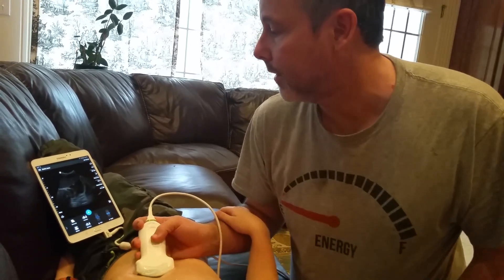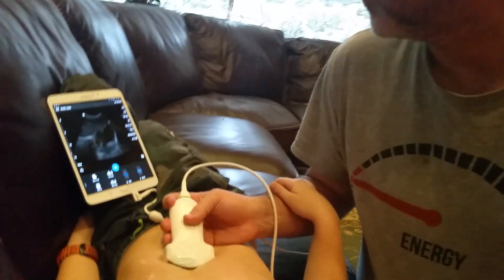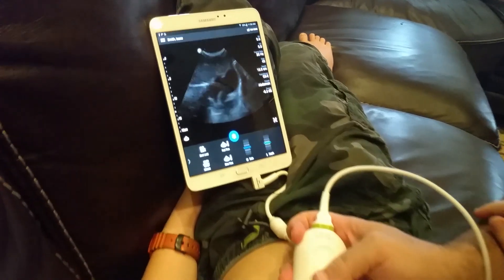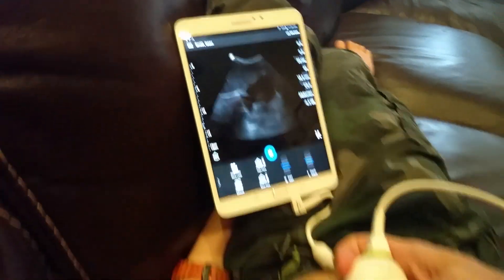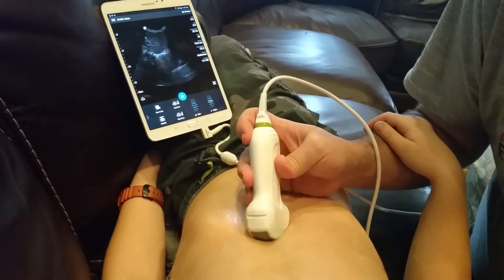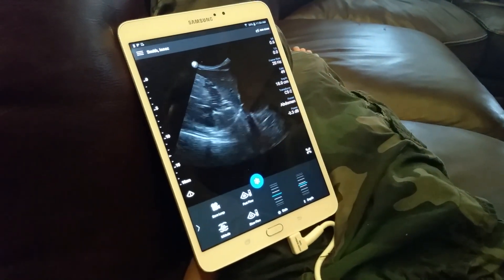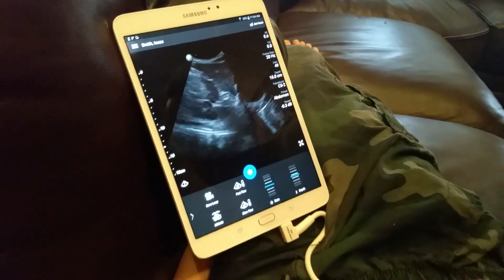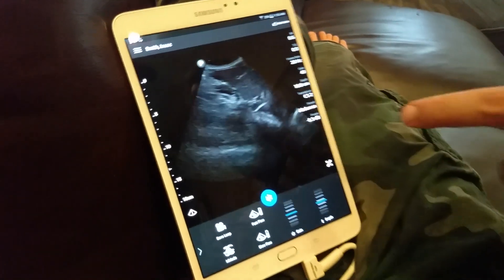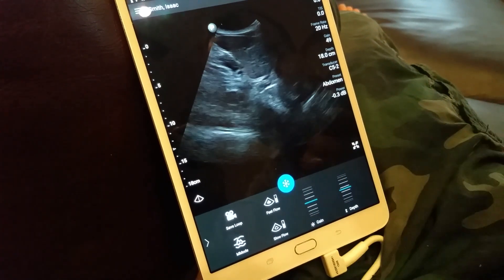To follow up with the subcostal view of the heart, you can get it in different planes and record different images. The goal is to get a good four-chamber view. To get a gross assessment of volume status, turn the probe approximately 90 degrees, trying to keep the right atrium in view. As you delicately adjust your imaging, you should start to see the vena cava right there.